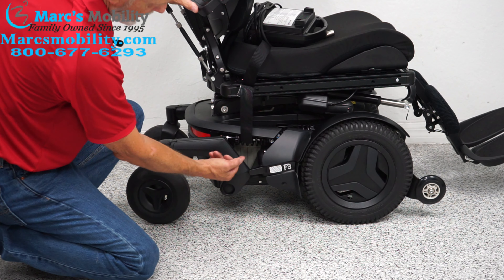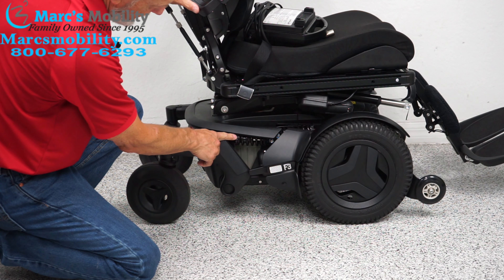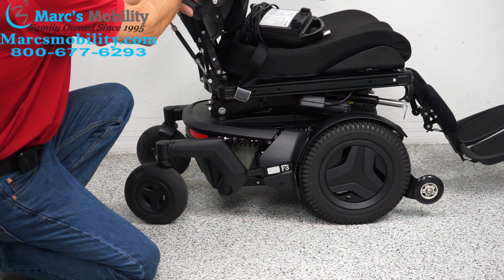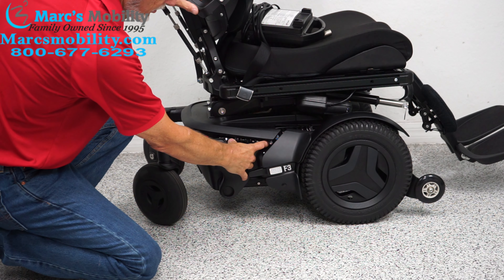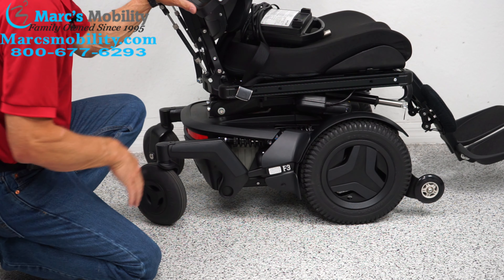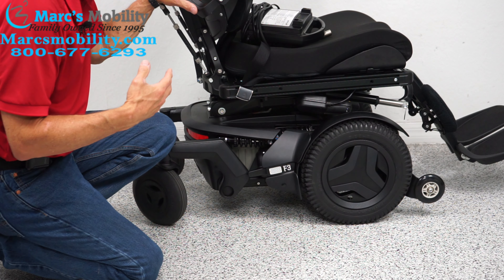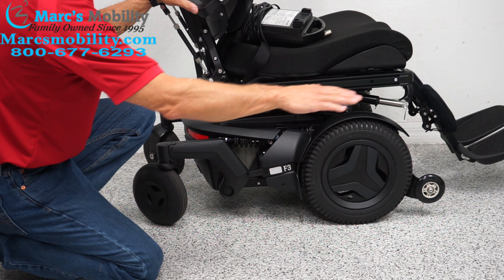You have suspension for the front and suspension for the back. You can actually see the suspension if I push down. You have four big shocks — two here, two more on the other side. This chair probably weighs right at 400 pounds, so with these shocks and the weight of the chair, that's why you get such a nice ride.